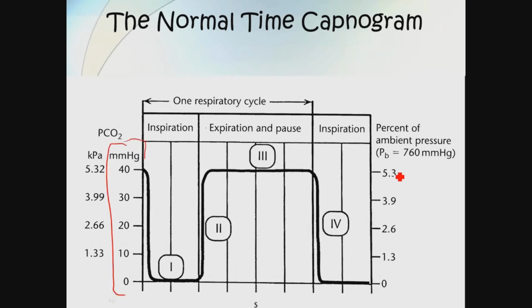Sometimes you'll see as a percentage. The old Easy Cap, if you look at it, the color changes. They had it marked off in percentages of CO2. And if you're really a nasty person, you flip it over so that it's now measuring in kilopascals, and everybody gets screwed up. That's what they do in Europe, not around here.